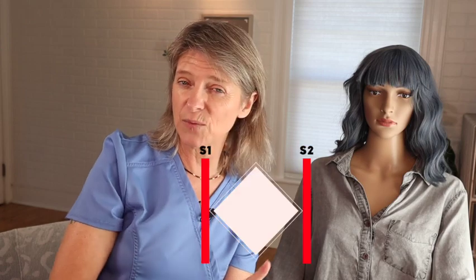So if you know what S1 and S2 sound like, then you're good to go to find out what is abnormal. Abnormal sounds are going to be either between S1 and S2, or outside of S1 and S2. It could be a snapping sound. It could be a roaring sound. It could be a musical sound. It could be all kinds of sounds.